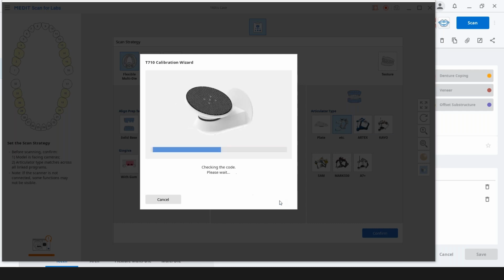So you actually place the calibration tool on the plate of the T-Series, correct? There's not a tool, it's just the plate itself. So this entire thing in the picture here actually goes on the swing arm. Perfect. With a magnetic fit. And it'll go through the procedure. You'll see the progress bar. There it comes now. And it's fairly quick, and we can show you how you can set that up to do on a schedule that fits your laboratory.